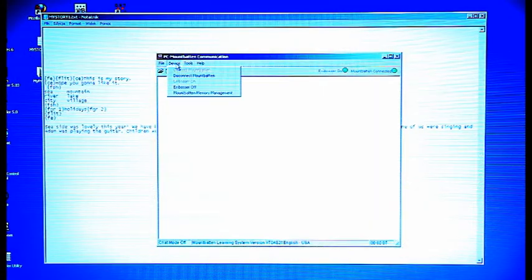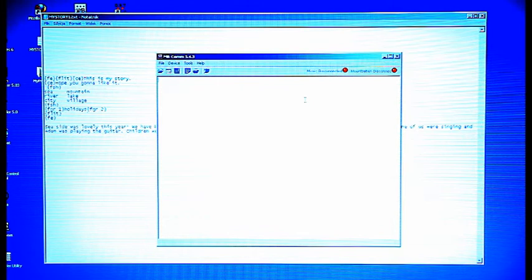To disconnect MBCom from the Mountbatten, go to the Device menu and select Disconnect Mountbatten. Alternatively, click the green button labelled Mountbatten Connected. You will hear the Mountbatten beep and say OK.